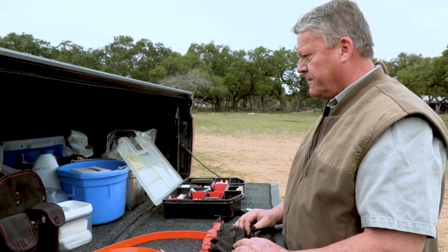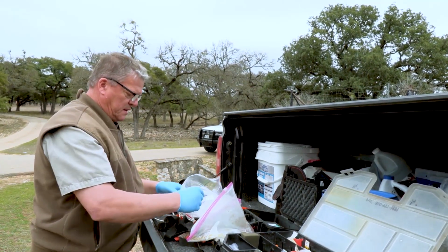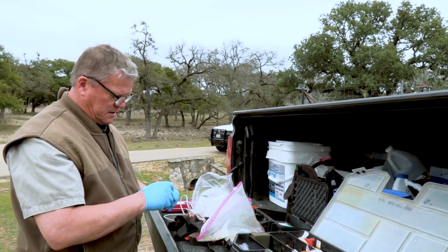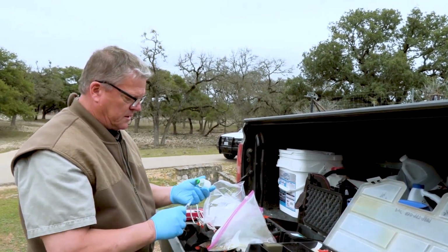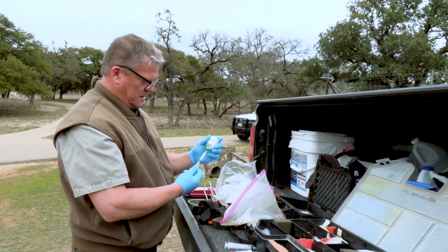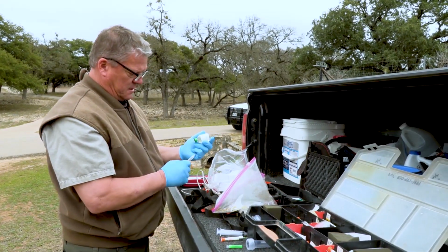We'll take her temperature. I know the calculated drug that we're going to use to immobilize her with. It's going to be thiafentanil. I'm going to draw up the reversal drug for that dose. And that's always important to do, to have that prepared and known what it will be before we ever proceed with the loading of the dart.